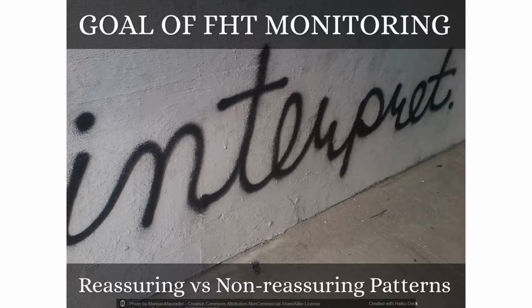The goal of fetal heart monitoring is to interpret, as I mentioned, but also to decide if it's a reassuring or a non-reassuring pattern. Your textbook stated it well, so all of the information I'm reading in this slide is on pages 382 and 383 from your textbook. Labor is physiologically very stressful on the fetus, so part of the role of the RN in labor and birth is to monitor the fetal status. Fetal oxygen supply must be maintained during labor to prevent fetal compromise and to promote newborn health after birth.